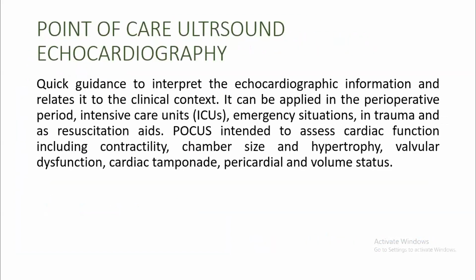So point-of-care ultrasound is a quick guide to interpret the echocardiography information and relate it to the clinical context. It can be applied in the perioperative period, in the intensive care unit, in the emergency department, in emergency situations, in trauma, in shock, and as a resuscitation aid. And nowadays it is also included in cardiopulmonary resuscitation. POCUS is intended to assess cardiac function, including contractility, chamber size, hypertrophy, valvular function or dysfunction, cardiac tamponade, pericardial effusion, and volume status. So it gives you a rapid assessment of the overall cardiac and volume status.